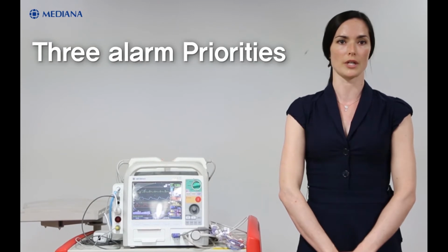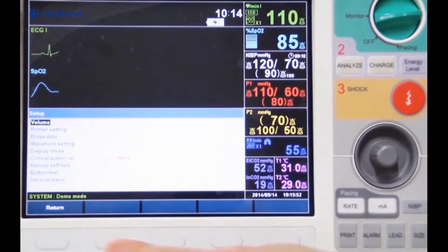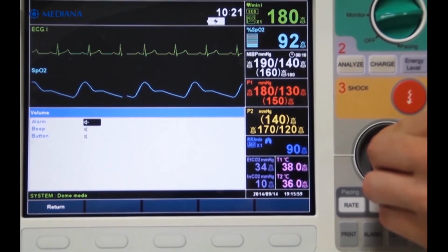When D500 detects certain conditions that require user attention, D500 enters an alarm state, and D500 response is indicated by audible alarm indication, physiological alarms including identification of out-of-limit vital signs, and technical alarms. And furthermore, 3 alarm priorities: high, medium, and low. To adjust volume, we can go into Setup menu and Volume menu. Then you can adjust the volume by the multifunction knob.